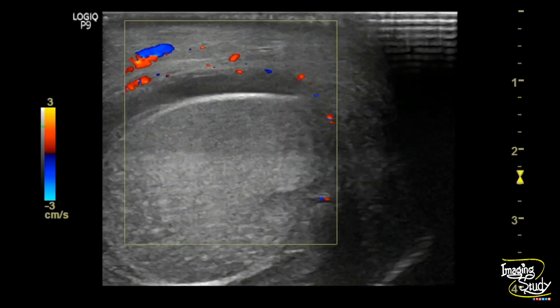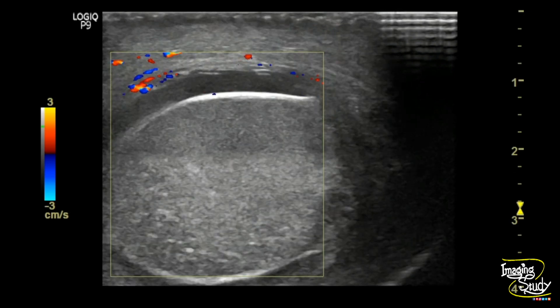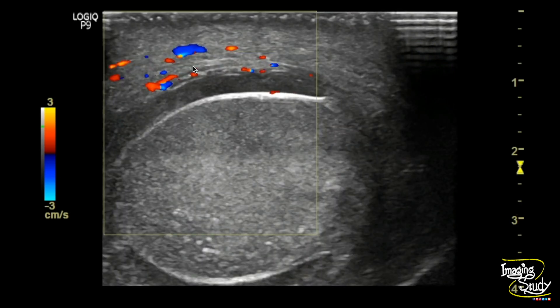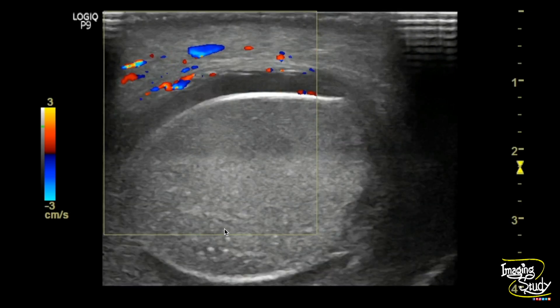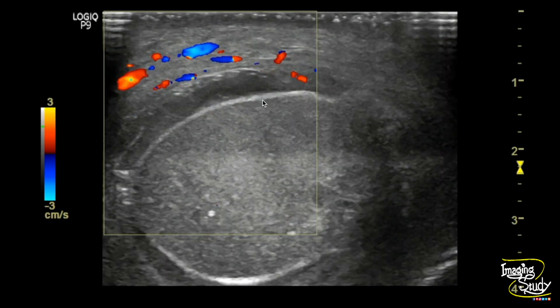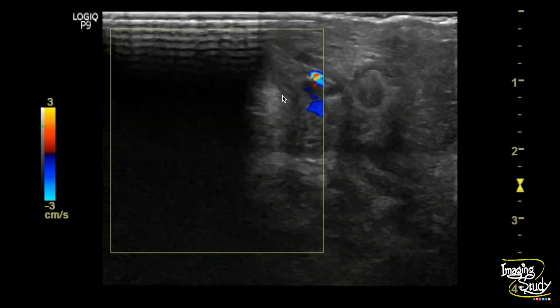On color Doppler, you can see there is a good amount of blood flow within the hemiscrotal skin, but you can't see any flow within the testicular parenchyma, indicating testicular torsion.